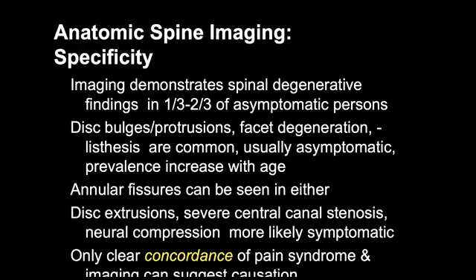So if you're not getting that information from the referring providers, giving a questionnaire or having somebody interview the patients to identify whether you're in the radicular category is helpful, which is actually kind of easier because if it's truly a radicular pain or sciatic pain, it's often some cause of narrowing, whether it's a disc herniation, synovial cyst, facet, or foraminal stenosis. The axial pain is much more elusive, but again, I don't think MRI is worthless in that regard because of the things that I discussed.